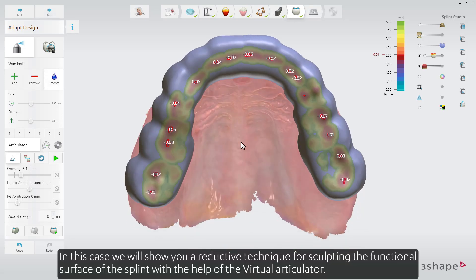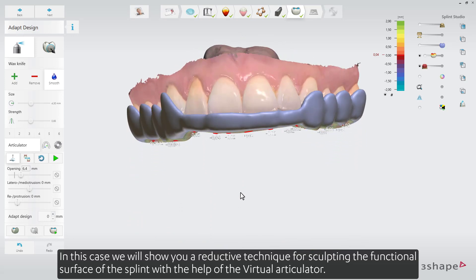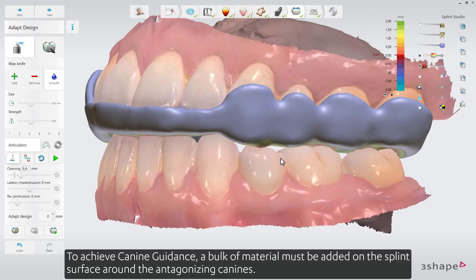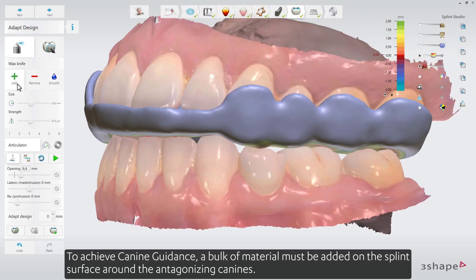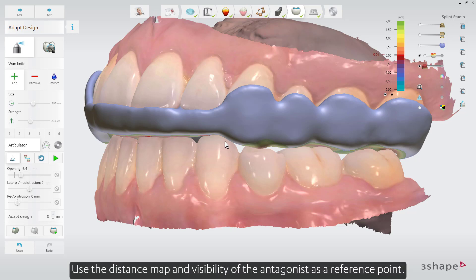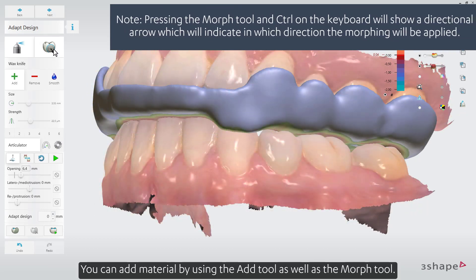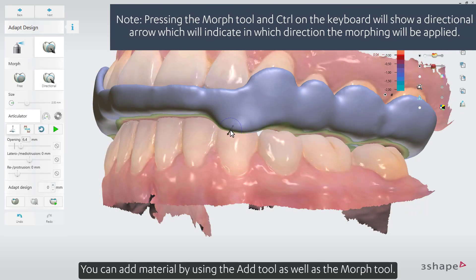We'll show you a reductive technique for sculpting the functional surface of the splint with the help of the virtual articulator. To achieve canine guidance, a bulk of material must be added on the splint surface around the antagonizing canines. Use the distance map and visibility of the antagonist as a reference point. The added material provides support for canine guidance in both lateral protrusion and protrusion. You can add material using the Add tool as well as the Morph tool.